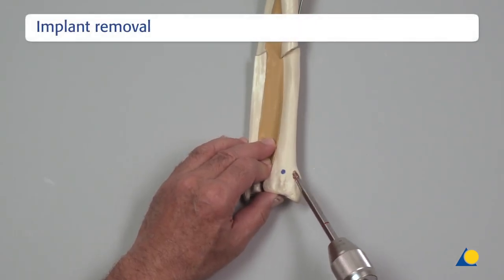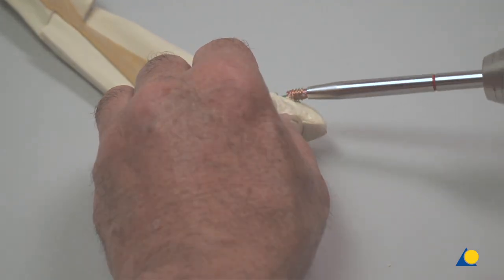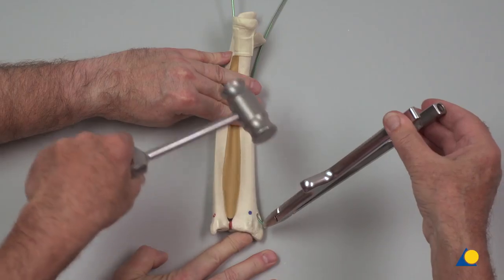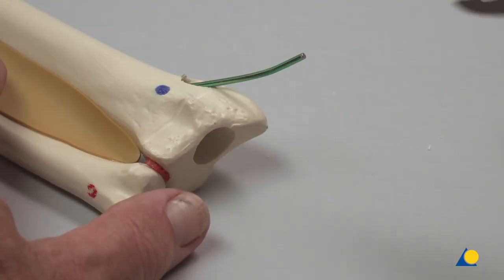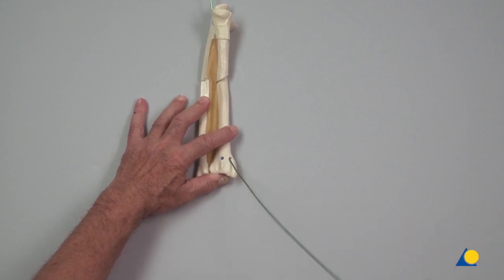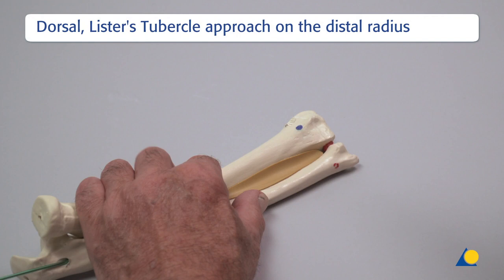End caps are removed using the same instruments as for insertion. The extraction pliers and mallet are used to remove the implant. Axial blows are applied in the beginning of removal. The nail is then loosened and removed manually using the pliers only.